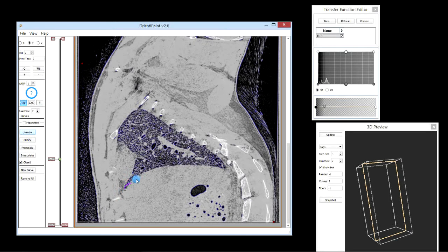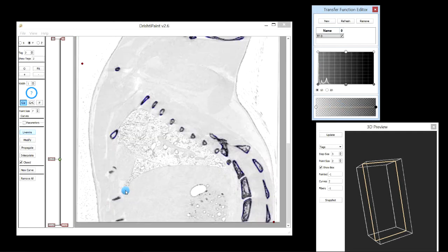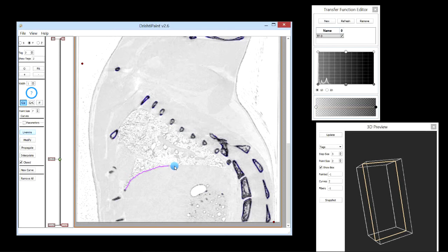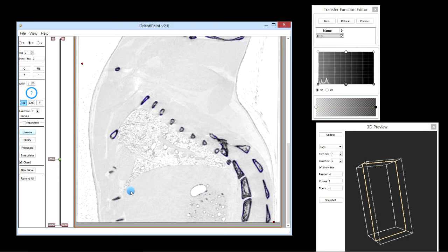Then you can put the point here. We might sometimes have to change the transfer function — let's flip it and see how it looks. It is going nicely here. Now if you make a mess of the live wire, for example, and realize this is not good, the easiest way is to press Escape. Escape will basically reset the live wire and you can start again.